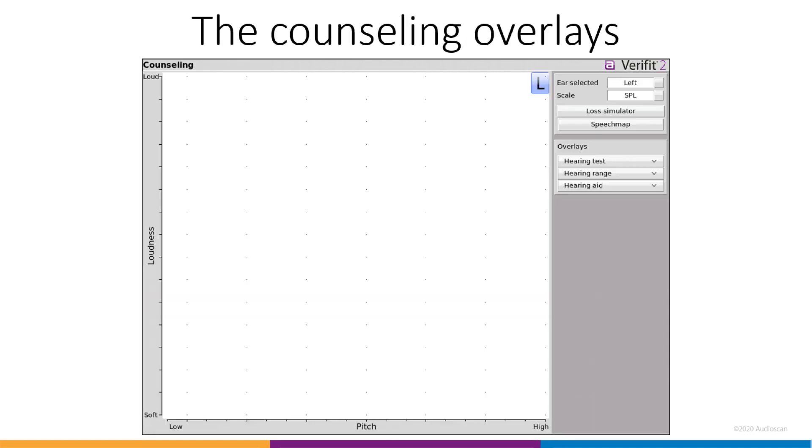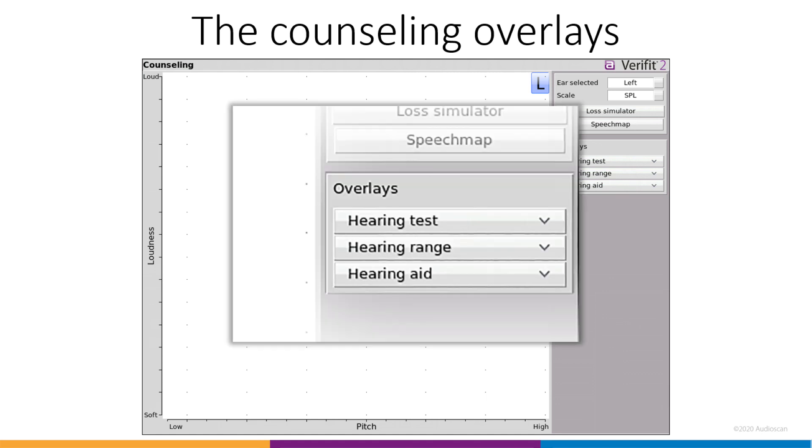The window opens to a blank graph. The hearing care practitioner is now able to turn on the elements that support their counseling protocol as desired. Each of these elements is considered a screen overlay, and the overlays are organized into three groups: hearing test, hearing range, and hearing aid.